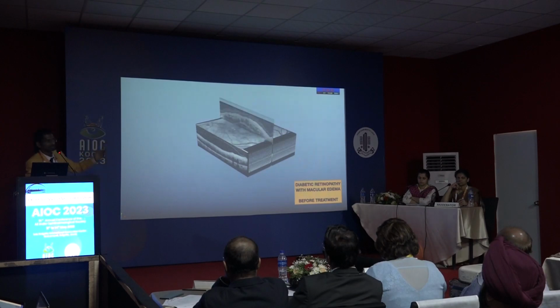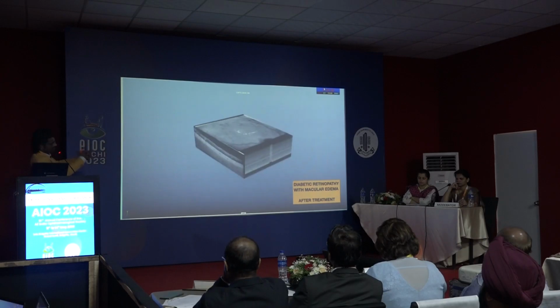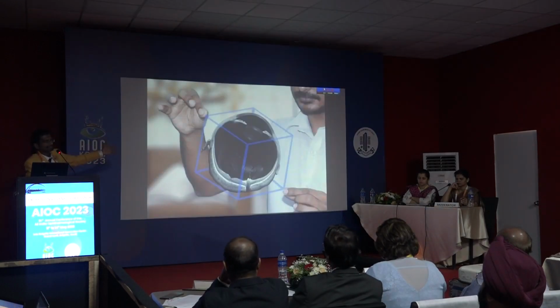Where there will be a 3-dimensional or a 4-dimensional EMR, where you can also see just in your smartphone, you can focus on this. You can extrapolate the OCT also out of it, because we have coded on that level that even it can be superimposed even on anterior segment images as well.